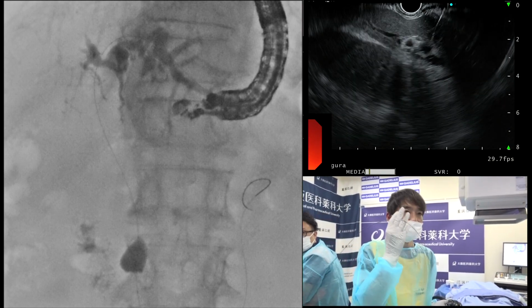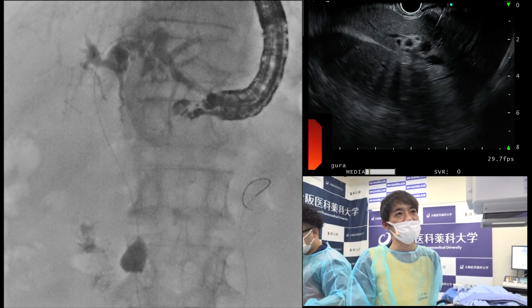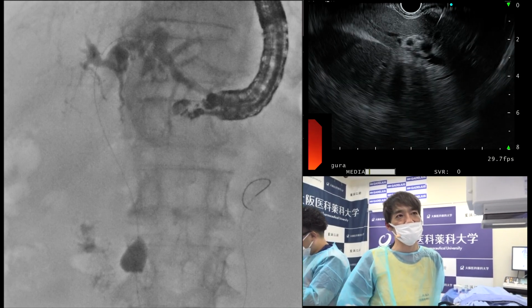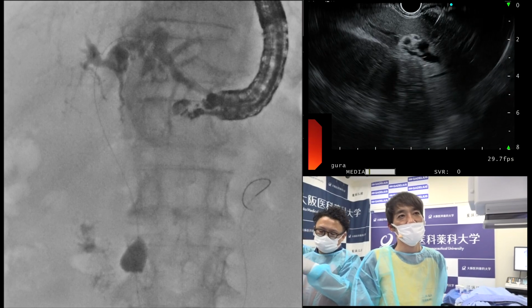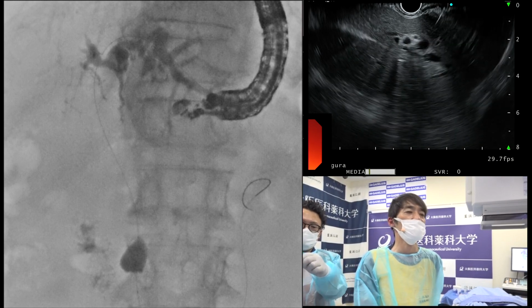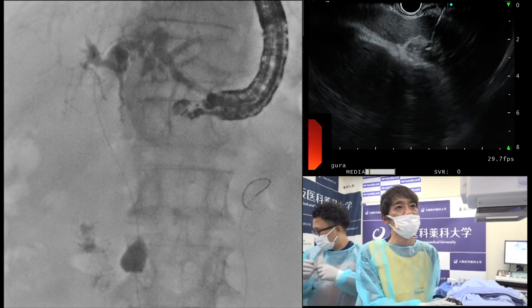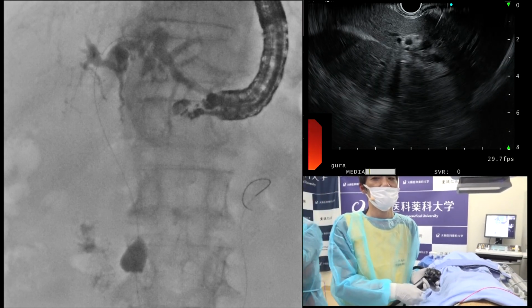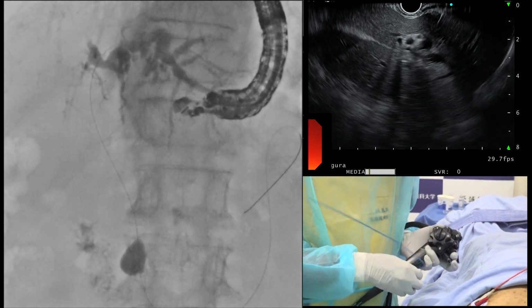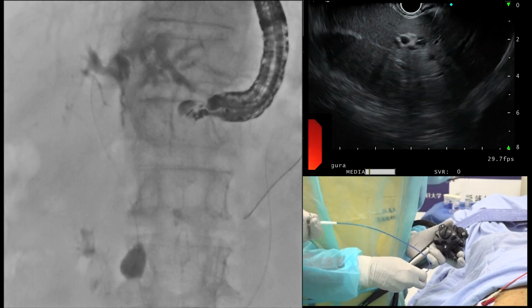The patient does not have a gastric outlet obstruction, does he? Yeah. But this patient did not experience a history of vomiting. But the scope cannot be inserted into the ampulla of Vater, so we don't deploy the duodenal stent. But if this patient develops duodenal obstruction in the future, I would like to perform EUS-GJ. I think that is also why it's very important that you release your antegrade stent distally to the duodenal obstruction. That's a very important point that you made.